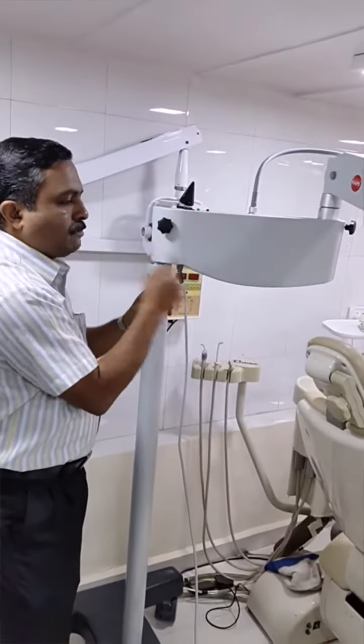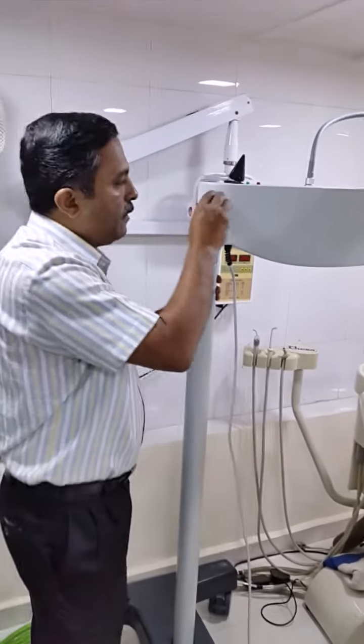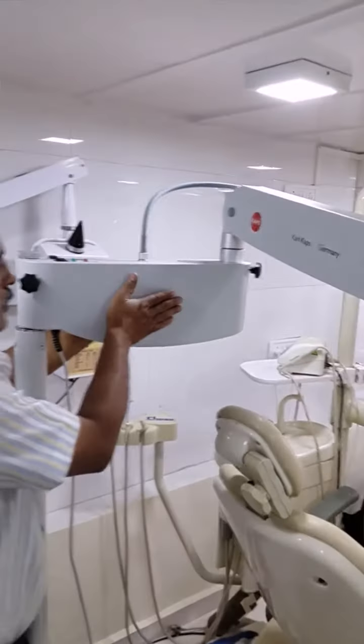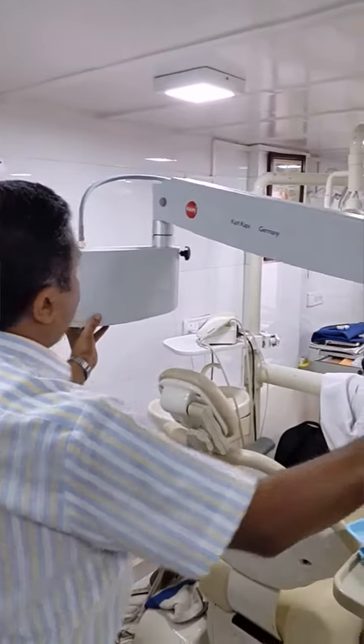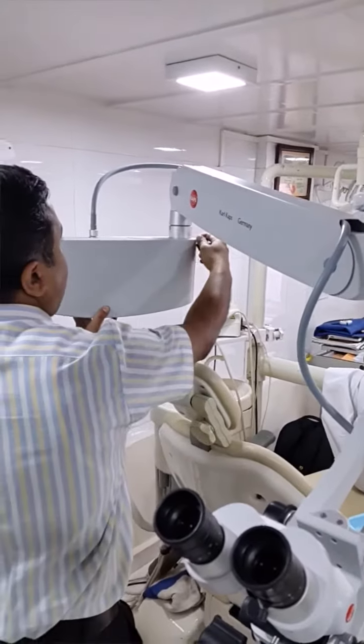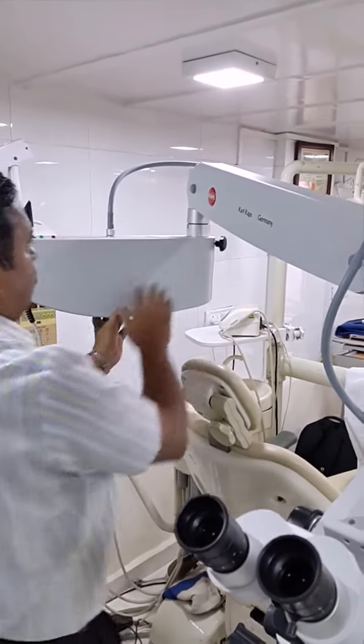If you tighten this, this movement will get locked. Then this is the swivel arm to suspension arm. The movement between swivel arm to suspension arm has also got a rotatory movement, which can be locked here with the help of this arm.